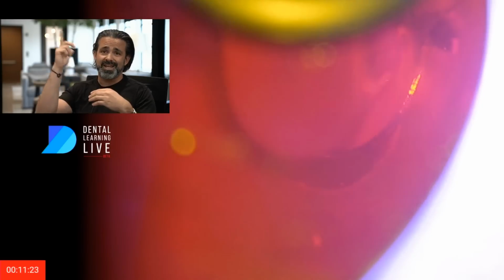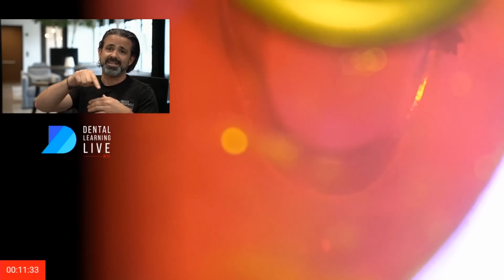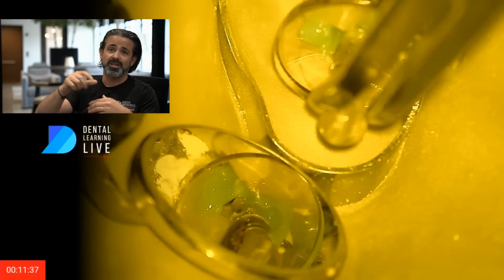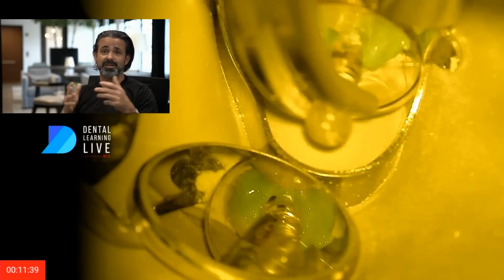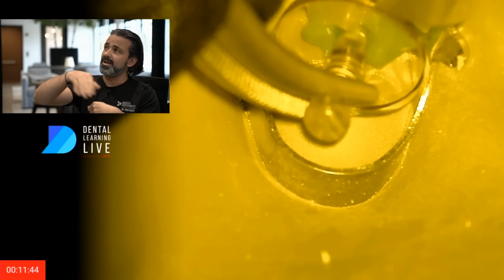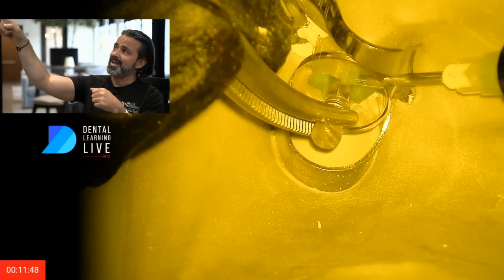Sometimes don't rush through this. If you let just the natural ambient light, maybe your microscope light's a little too powerful, but if you let it get semi-set, not a full cure state, it's actually easier to draw it and not gouge it when you touch it with an Explorer, if you get a little jiggles, if you had too much coffee, too much caffeine in your hands or something. So you can have a steady hand and it not dish out that wall. And so I painted it in. And then I replaced the matrix.